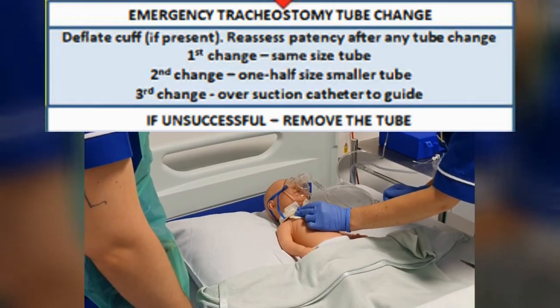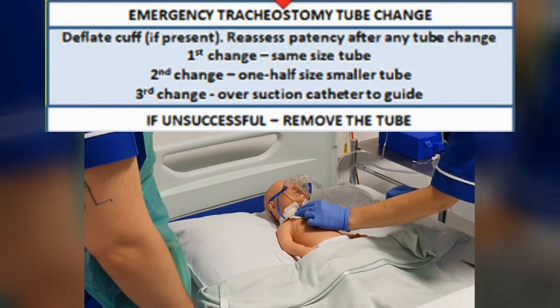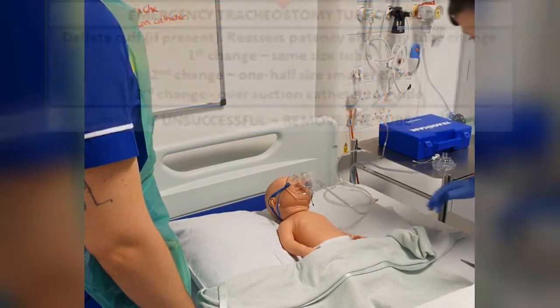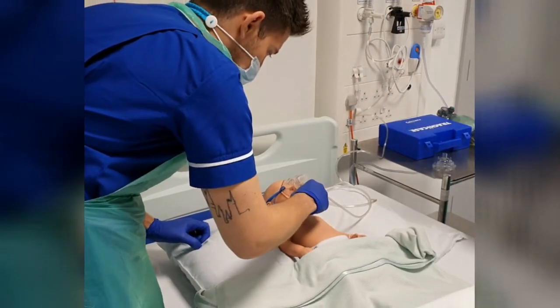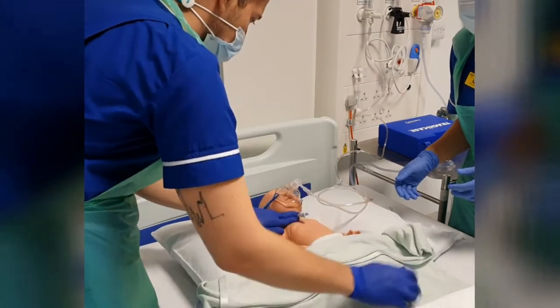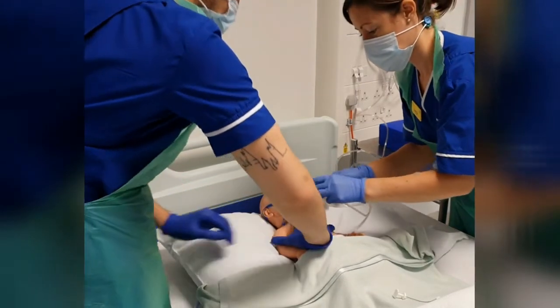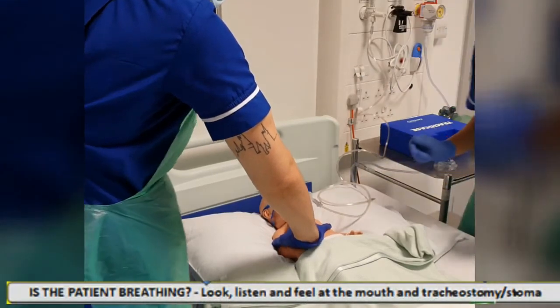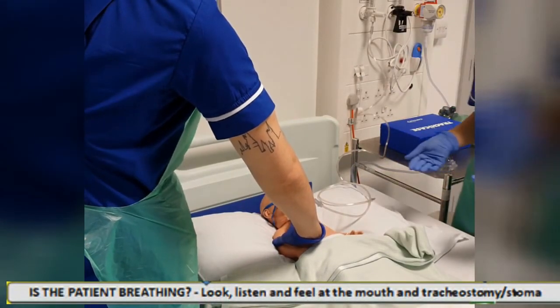I'm going to remove the blocked tracheostomy. Sam, are you ready to insert the new one? I am. So now we've reinserted the new tracheostomy, we're going to assess our patient.